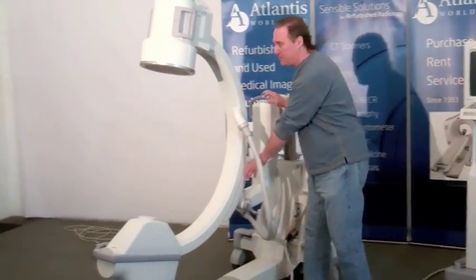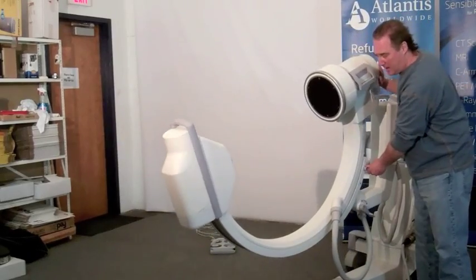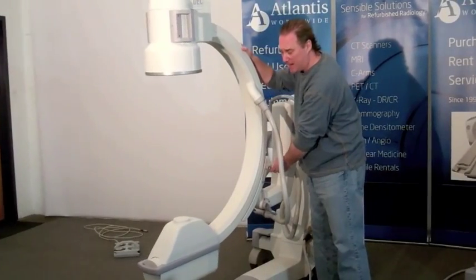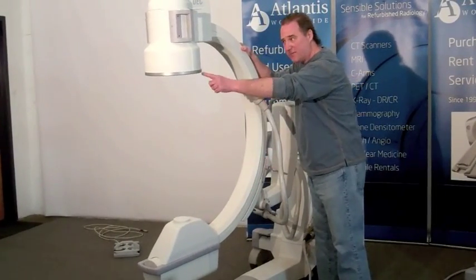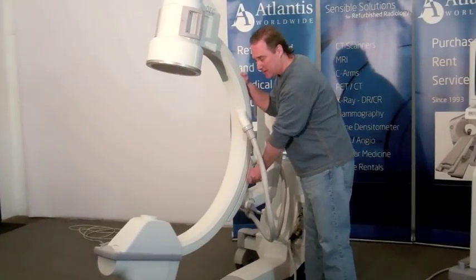Here we have a lever that, when you loosen it up, you can move the C-arm up and down as you see it. You have the x-ray tube at the bottom right now and the image intensifier at the top. Once you've established where you'd like to have it, you can lock it in.